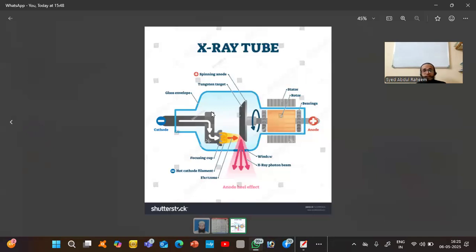So that is the reason the X-ray room, CT room, and MRI room are very highly packed and sealed, and they keep the machine in AC at low degrees Celsius so it will always cool down. Whatever kinetic energy we are sending, only 1% will convert into the X-ray wave. The other 99% is heat surrounding the area.